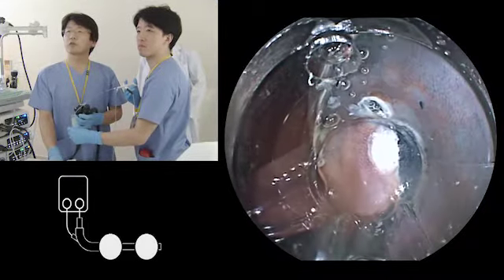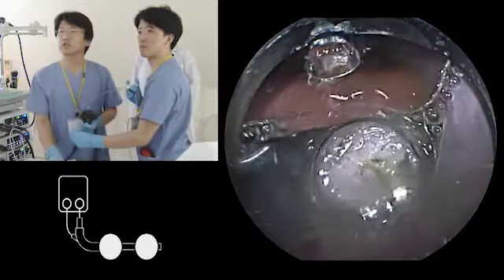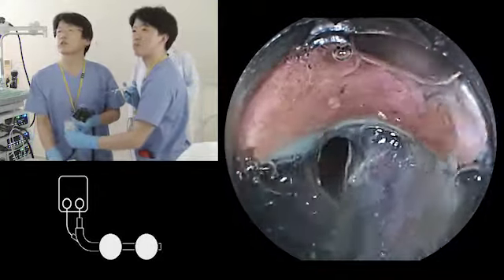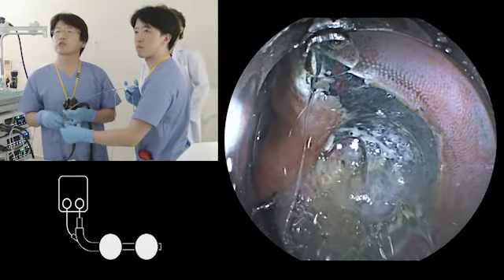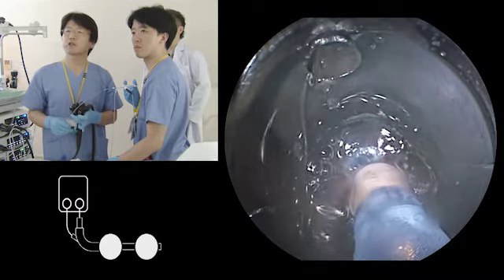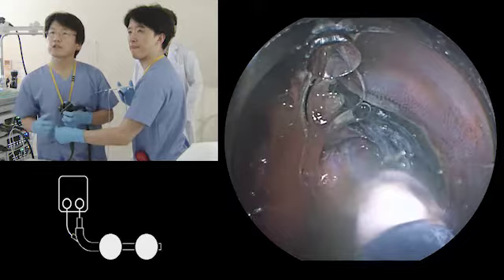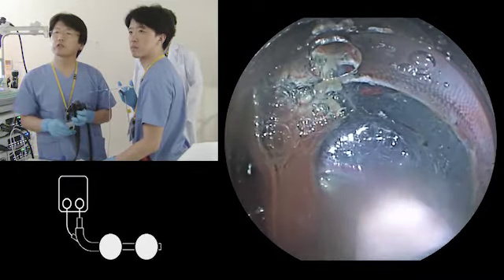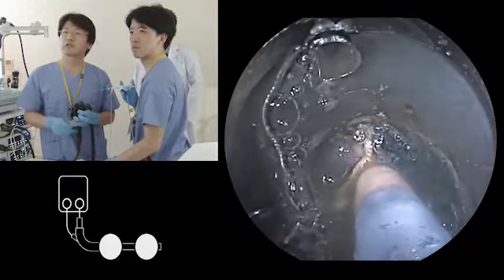So when you open the pocket, don't cut the mucosa all the way down. Don't make a circumferential incision yet. Cut a little bit, about 1 centimeter, and that 1 centimeter should be dissected before the fluid goes away. As long as the mucosa remains intact, you can add fluid anytime and make a very good elevation. And as long as you have good elevation, the dissection is safer. After you open the pocket, the condition becomes a little bit unstable, but as long as you have a good strategy, you can manage it.